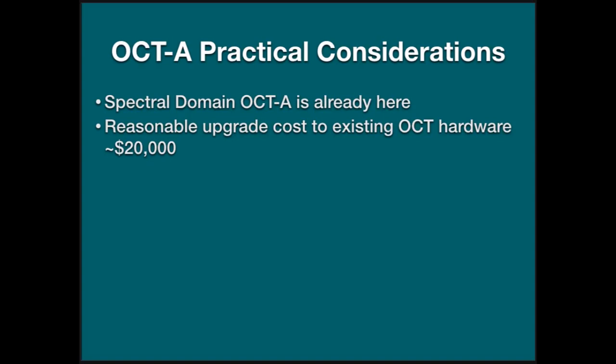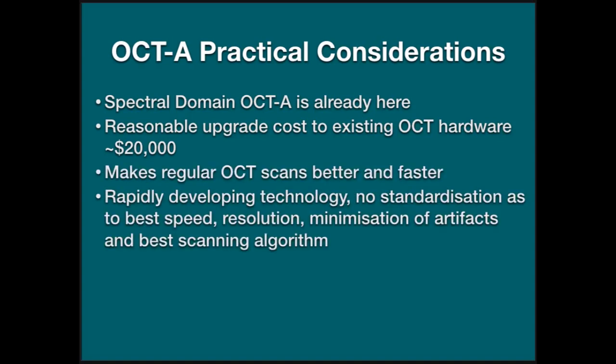And as I said earlier, it not only does angiography, it speeds up the OCT itself. The scans go much faster, the image processing is much, much quicker. So it's a really nice upgrade to have. However, OCT angiography is rapidly developing. There's really, at this stage, no standardization.